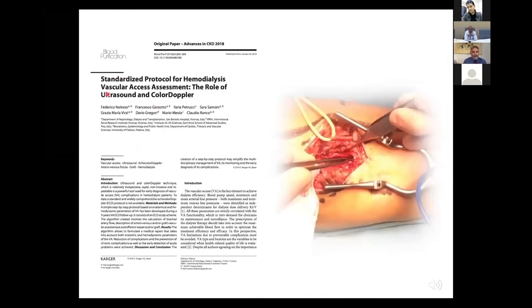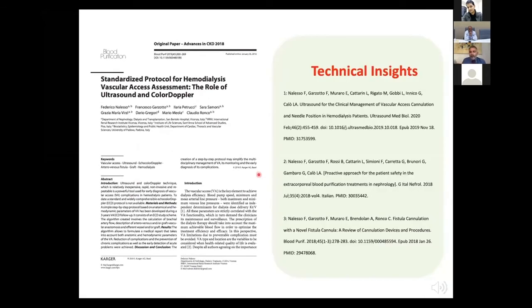With this paper, we introduce a vascular access study algorithm to standardize the exam and make the vascular access analysis reproducible by different operators. Here are cited other papers that may be useful in the analysis of vascular access.